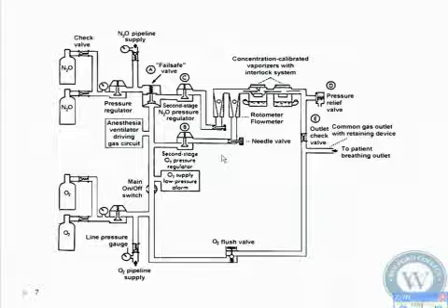Air doesn't kill people. Exactly. You can't give a hypoxic mixture with air. So you used to have fail-safe valves on everything except oxygen, but you don't any longer because now they know you can't kill people with air, and air is used on the newer machines to drive the bellows. And if you had a fail-safe valve preventing that, then only oxygen would have to be utilized to move your bellows up and down, okay? So it's a cost-saving feature as well. Air is cheaper than 100% O2.